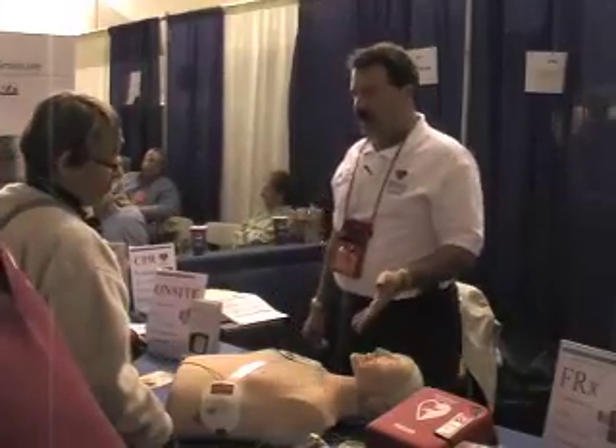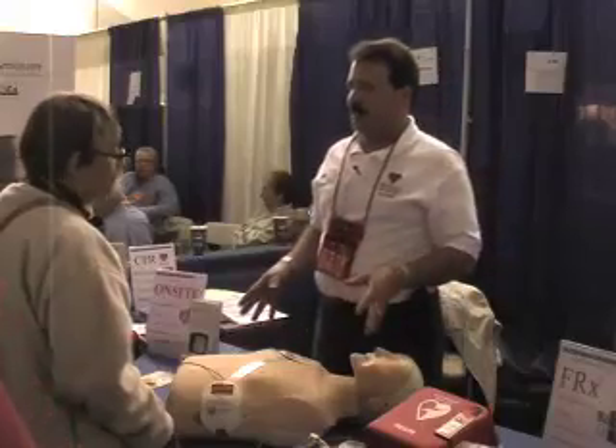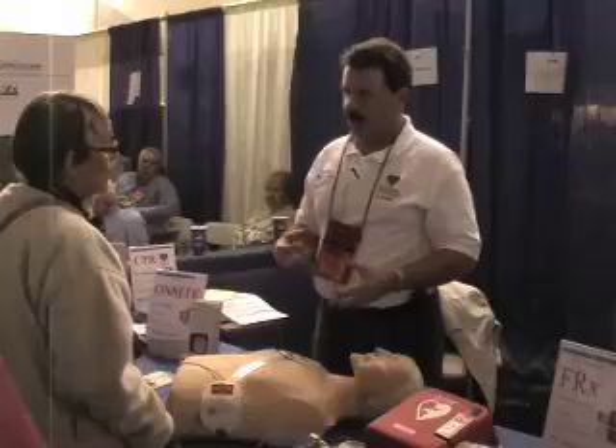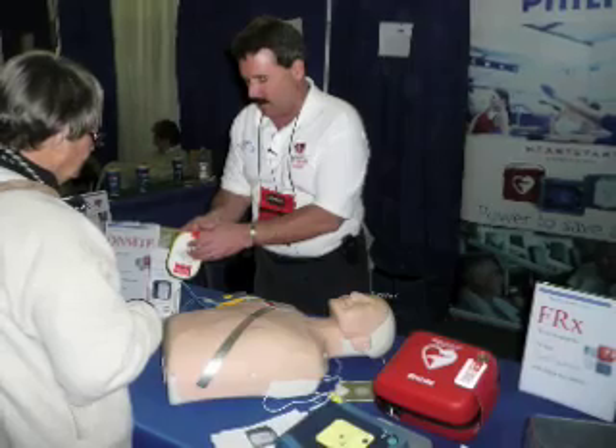It'll let you do that for two minutes and then it'll tell you to stop CPR because it wants to reanalyze to see if the heart is now back into a normal rhythm or not. That's all, thank you.